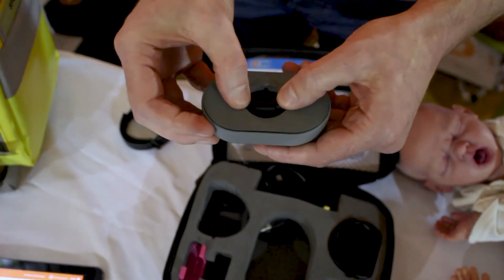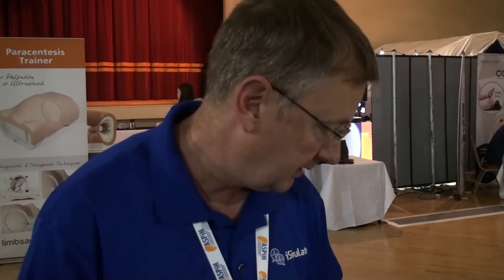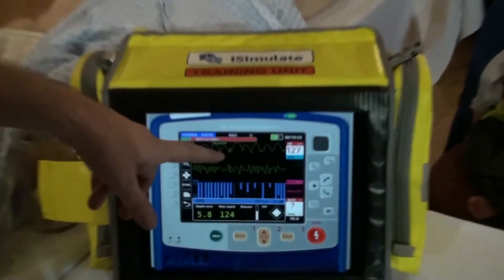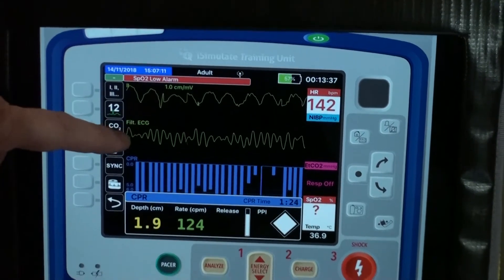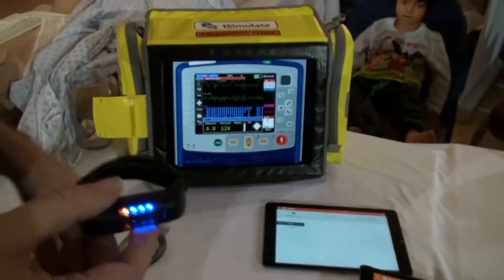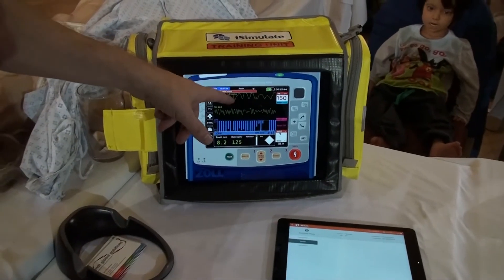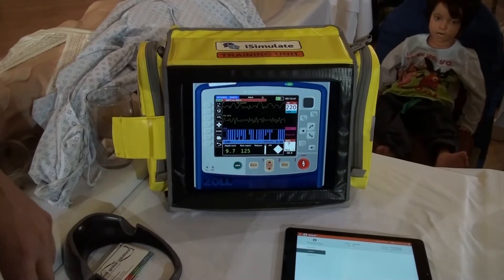We're able to take data from a number of different sources to recreate your CPR. At the top part of the screen, here's your CPR artifact occurring. We're using see-through CPR on the Zoll here, so you're able to see beyond that. But this device on its own will recreate the CPR artifact and stop students from staring at the screen if they don't have see-through CPR.